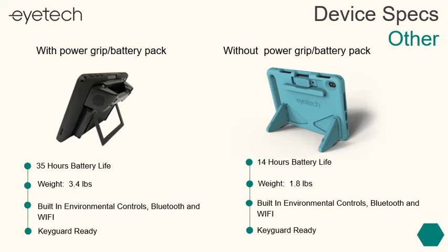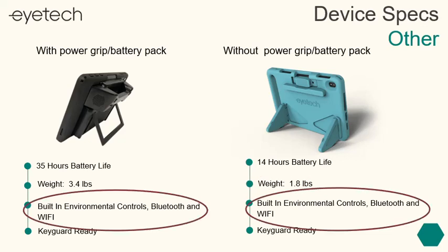Removing the battery pack brings the battery life down to 14 hours, which is still impressive, and it brings the weight of the device down to a little over 1.5 pounds. Both options have the benefit of having access to environmental controls, Bluetooth, and Wi-Fi.